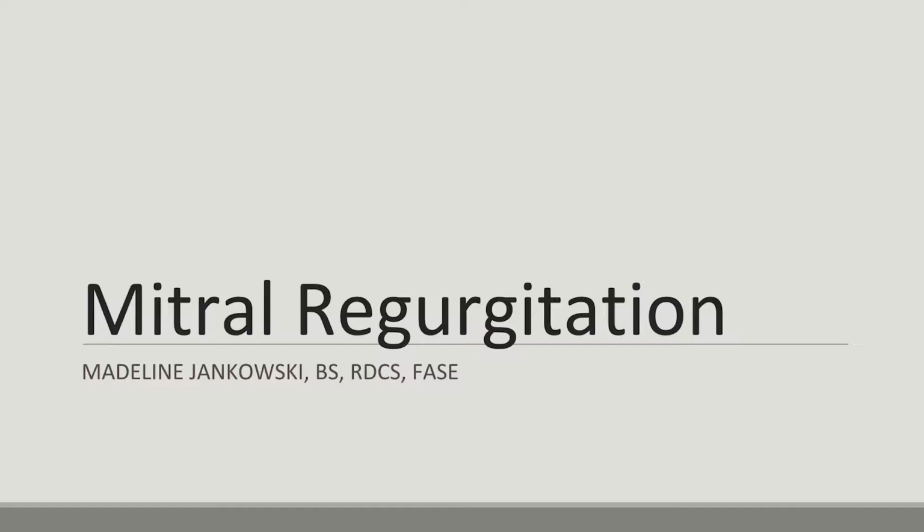Today I'll be talking about mitral regurgitation with a heavy focus on scanning techniques for sonographers.